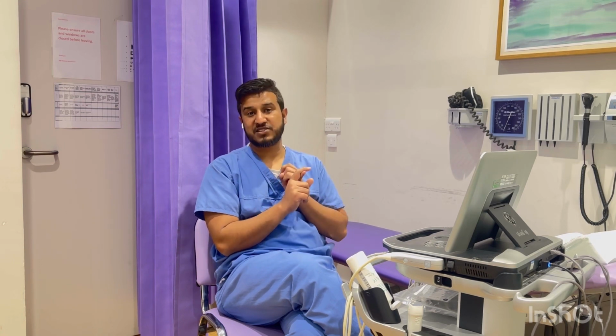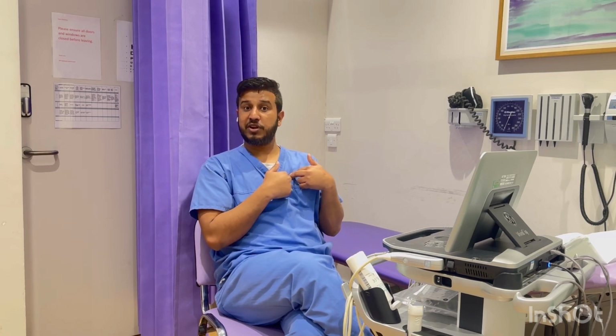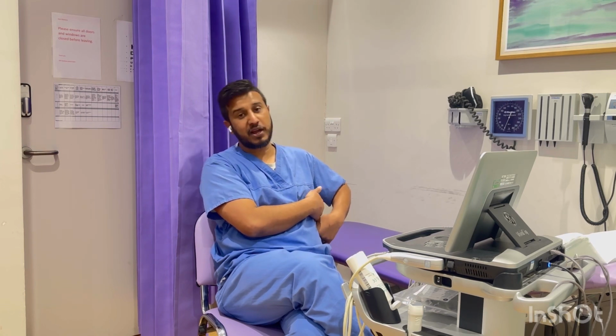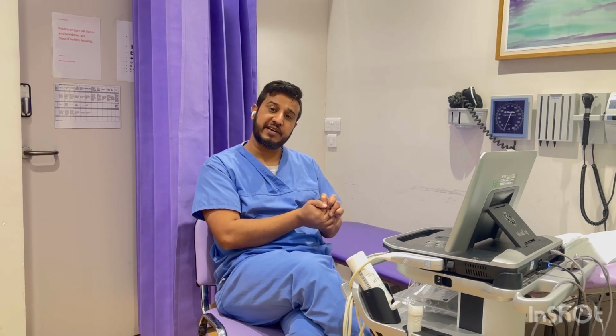One is the parasternal window, which is just near the sternum, either on the right side or on the left side. The images you get from the parasternal window are called parasternal views. The next one is the apical window. You go onto the apex of the heart and you get the images from there. That's called the apical windows or apical images.